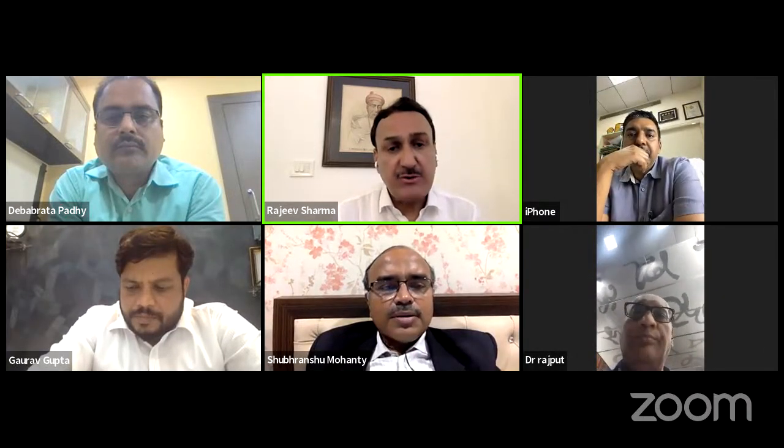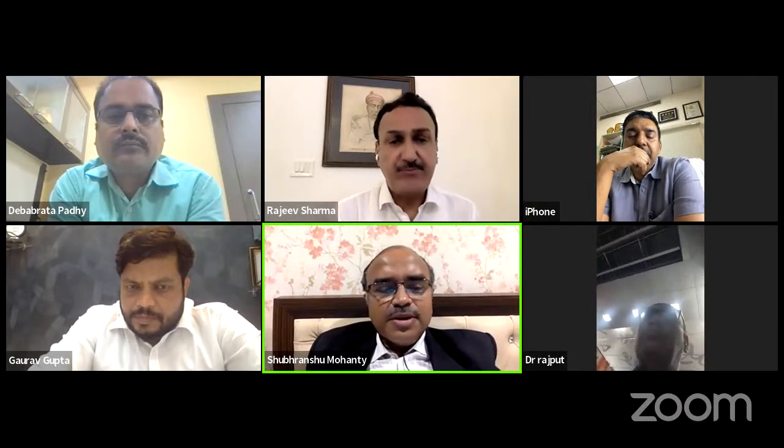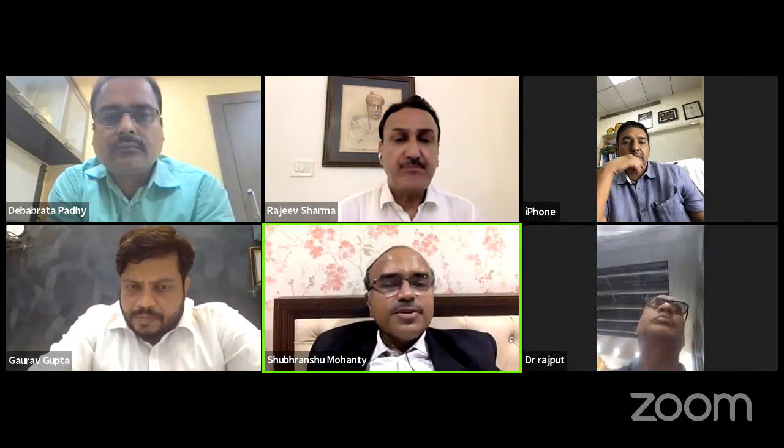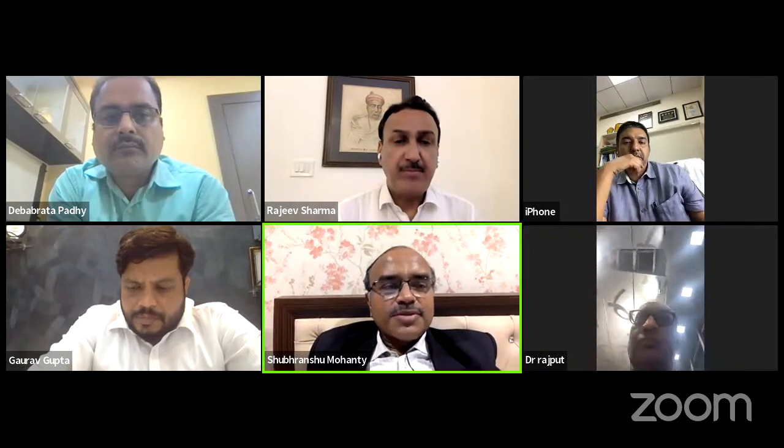What do you say, Shubhranshu, on this? Yeah, I go by the Richard Scott principle. Suppose in a varus knee, if you leave the leg like that on the table, when your alignment is good, then a couple of 2 to 3 millimeter laxity is acceptable. Right. But your alignment should be good. Yeah, it should be neutral aligned.